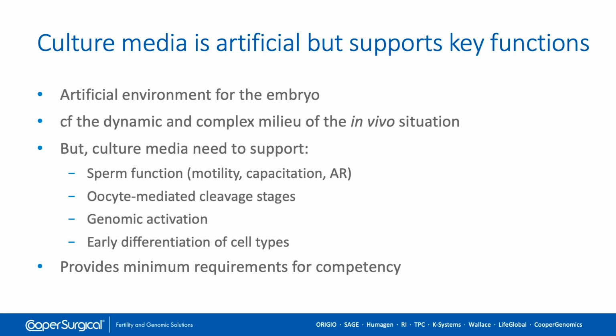Fortunately for us, the media that's currently available allows us to support those things such as sperm function, egg mediated cleavage stages, genomic activation and the early differentiation of cell types, and of course it provides the minimum requirement for competency in these different cells.